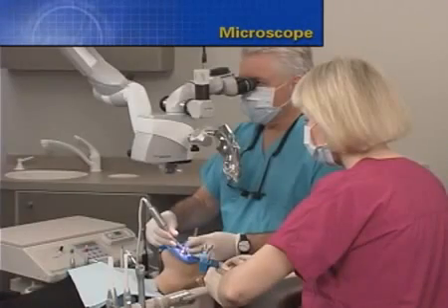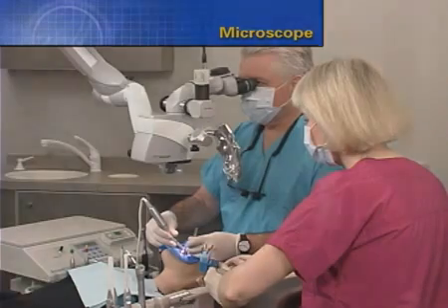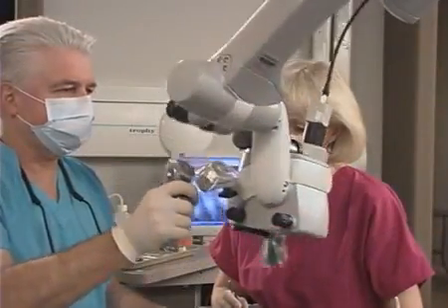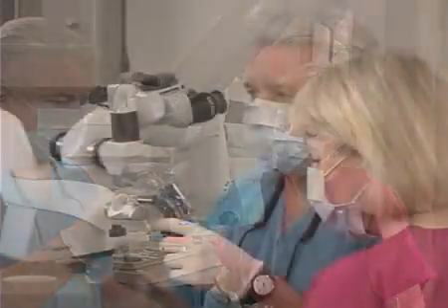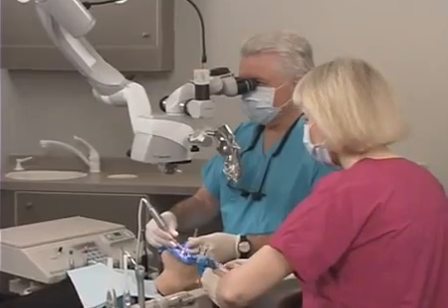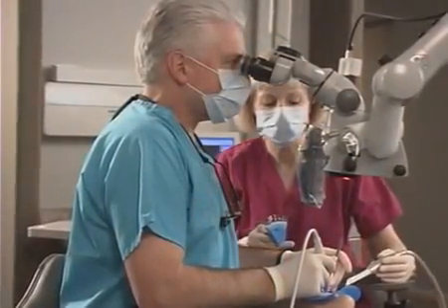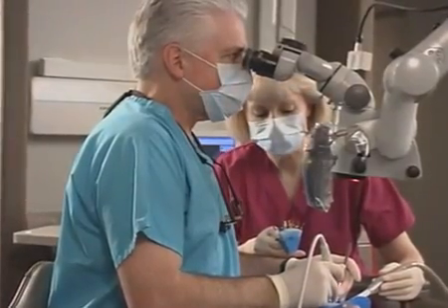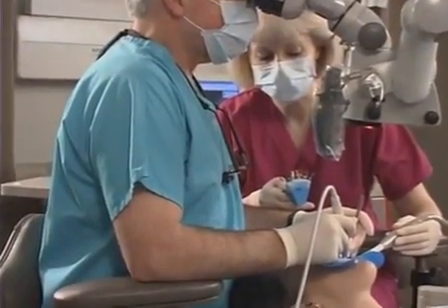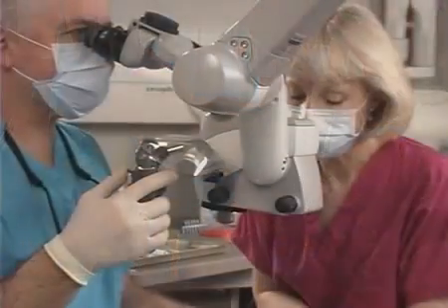The dental operating microscope is a critically essential part of the armamentarium in non-surgical retreatment. In my experience, Carl Zeiss has a line of superior products. Specifically, the Pro Ergo has magnetic clutches. This feature, in conjunction with rotatable and inclinable oculars, allows us to get into great position for patient care. Doctor stools are important with the armrest feature because it allows us to have shoulder support and lumbar support so we can be comfortable during our procedures.